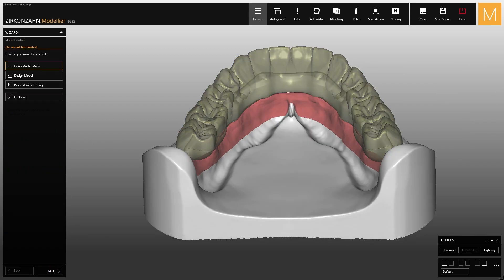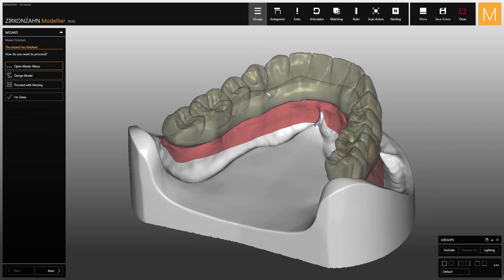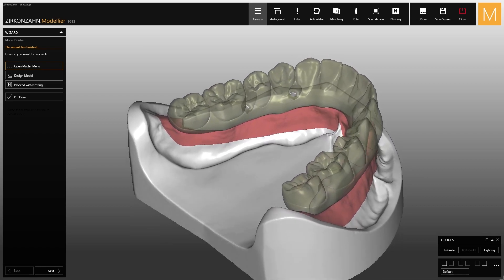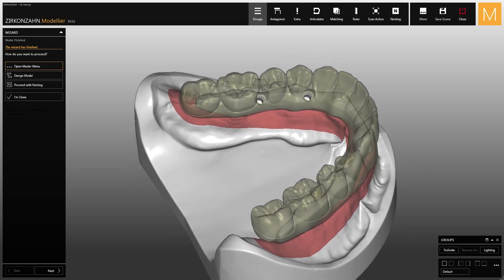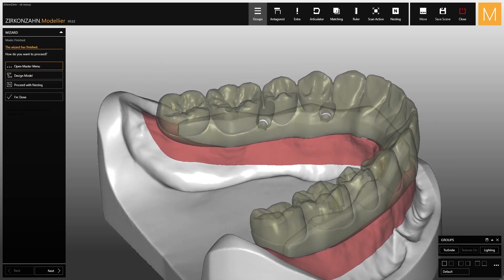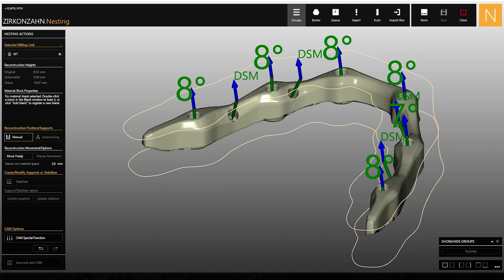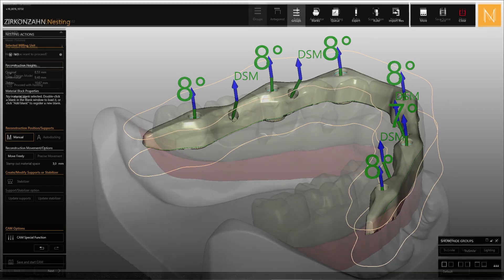As you can see, there are geometries in the secondary structure that create a stop for the screw head. These stops correspond to the threaded channels of the bar in which the screws will be screwed into. The threaded channels created with the DSM attachments are automatically recognized by the nesting software, which will indicate the appropriate milling burrs and strategies to create the screw thread in the metal bar.